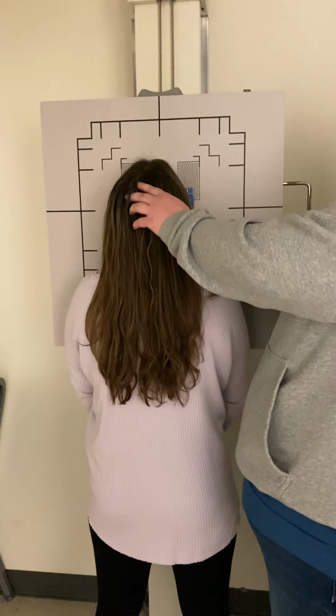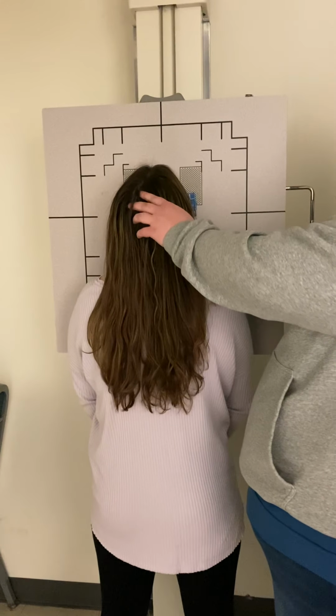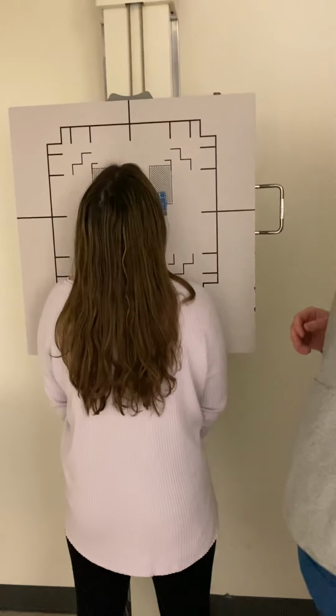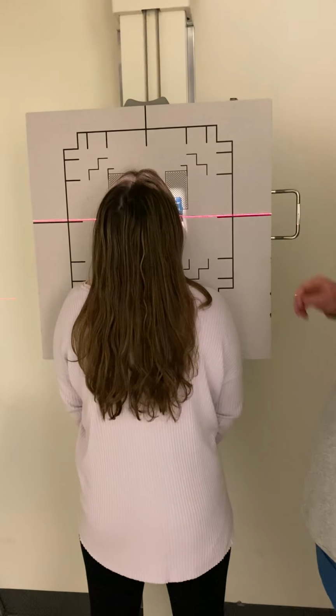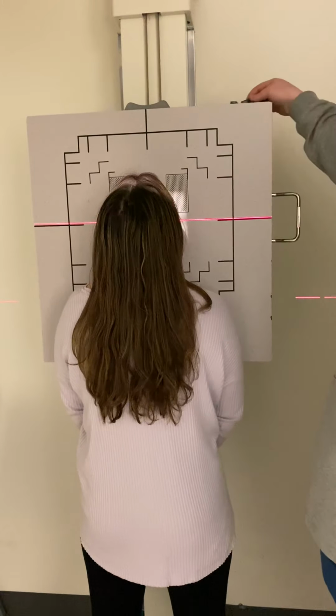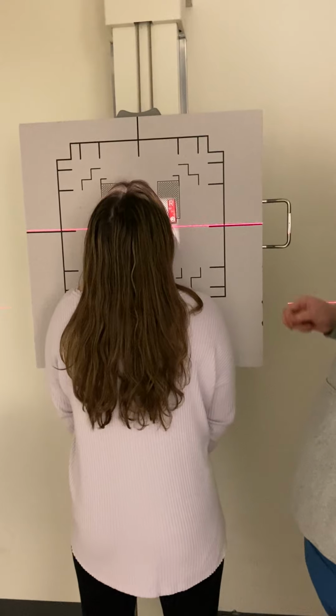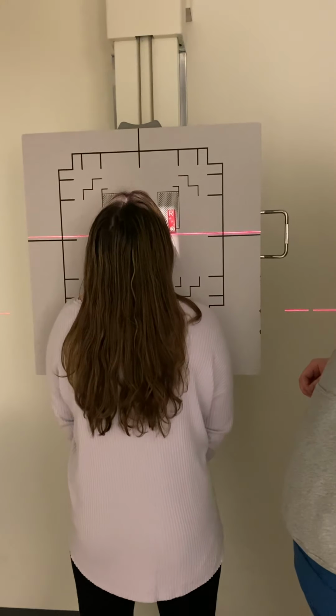So OML, that's about 50 degrees. And we're going to exit the acanthion on this one.